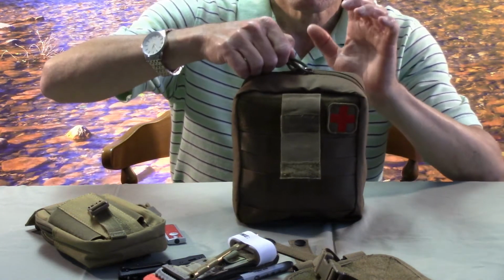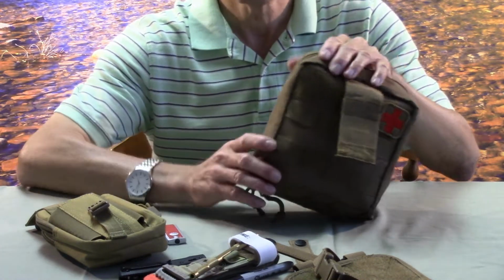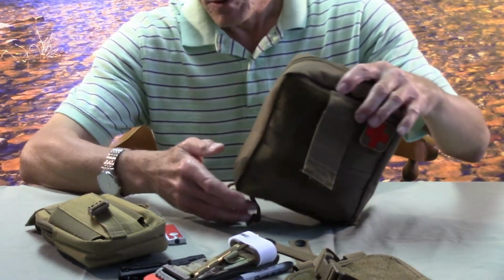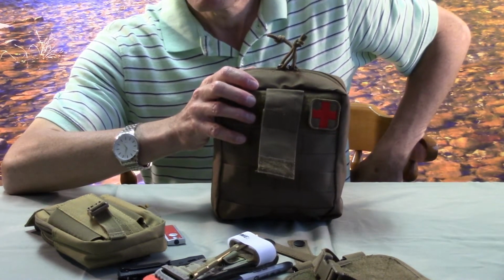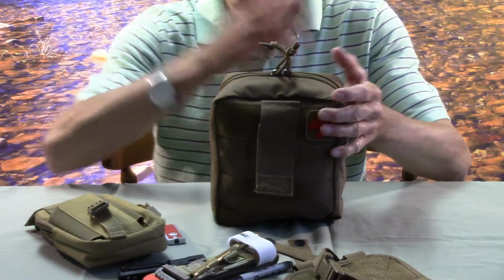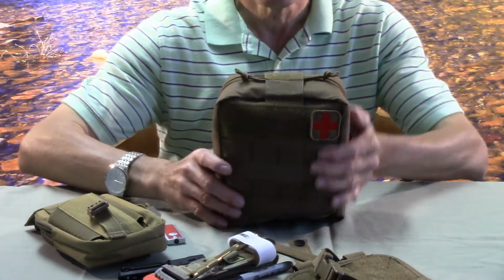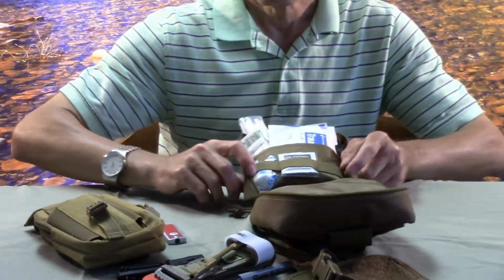But the way I set up my IFAK pouch, a lot of people will actually bring the zippers down to the side. The reason behind that, I think, most of the time is just because they're worried that it's going to come unzipped in this position. If you get snagged on something, it might get pulled down, and you might start losing some contents. And that's a good point. But if you're in an emergency situation and it's on your side, let's just say you decide to keep it on your belt, do you know which side those zippers are on? Or even if you rip it off, now it's facing in another direction. Do you know which side the zippers are on? And in a life or death situation where seconds count, that could make the difference. So that's kind of a long way of telling you that personally, I prefer having the zippers on the top. I always know, pull that off, and there you go. It opens right up. Enough about that.